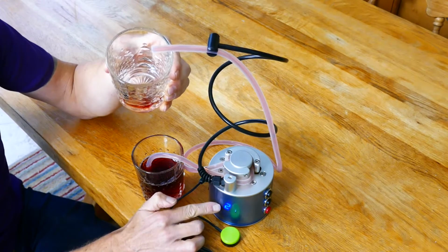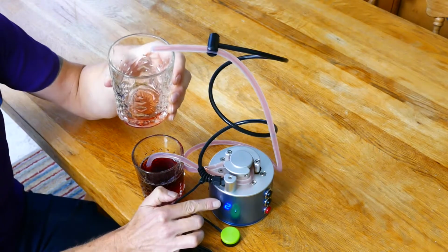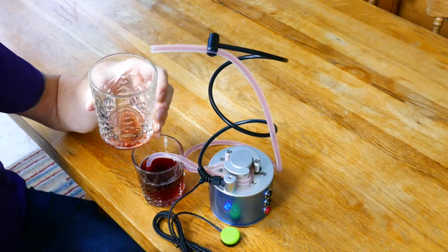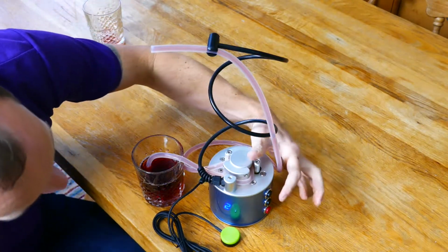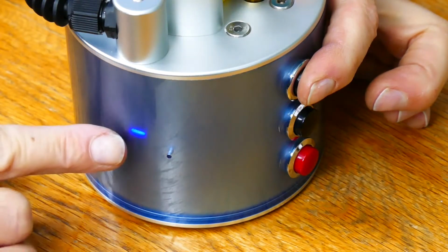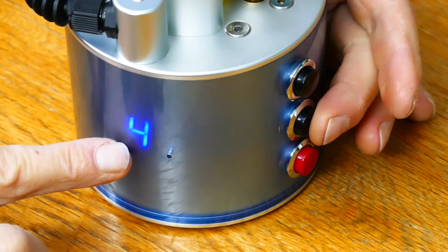Now we can change the amount. This number here tells us the amount. We've got numbers 1 to 6, 1 being the smallest and 6 being the largest. So to increase the amount of drink pumped, then we're going to use these two black buttons here. You press and hold the top button until you see the dash, then you press the middle button to select the number that you want.